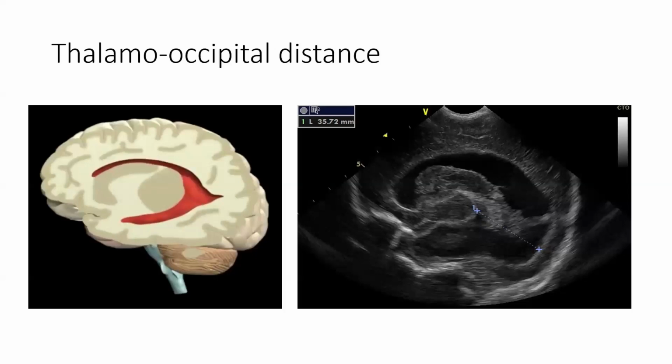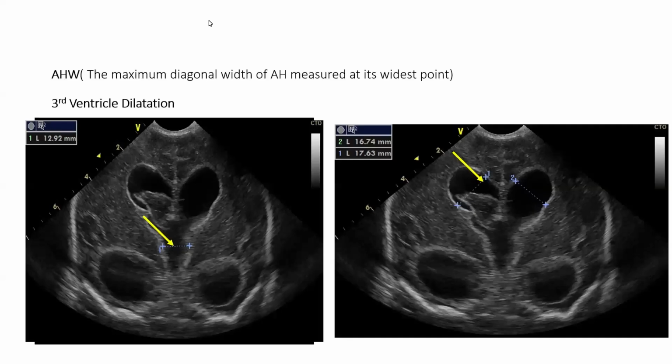Now the slide we are able to see is the third ventricle diameter.